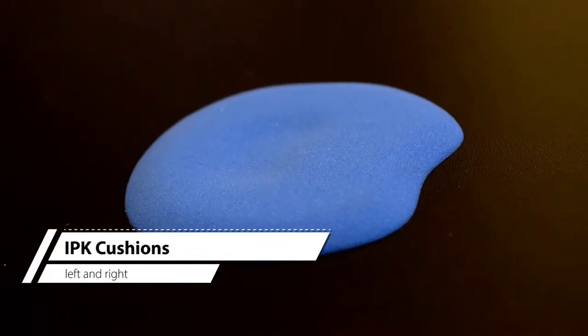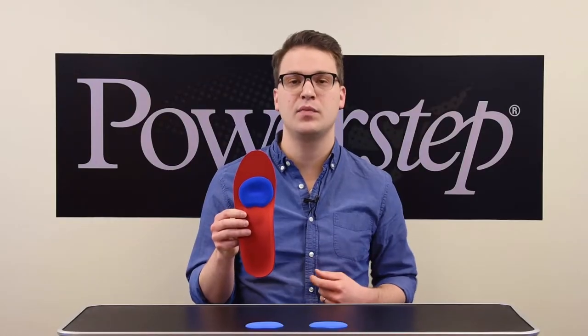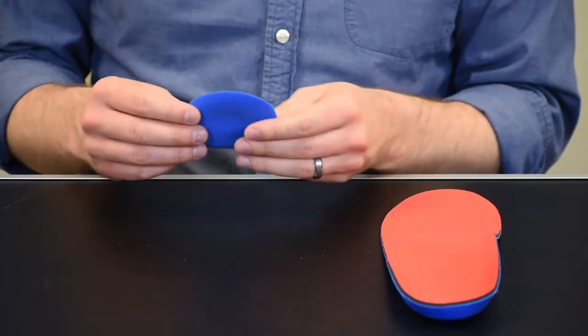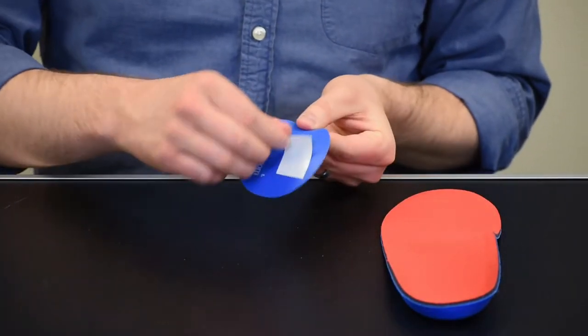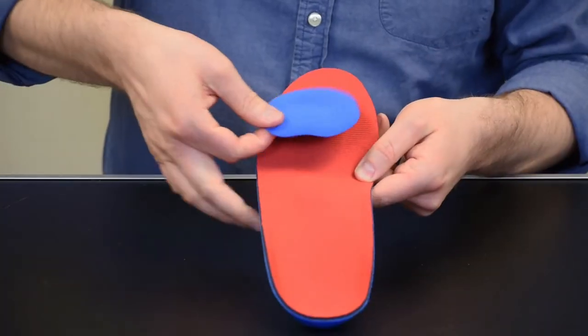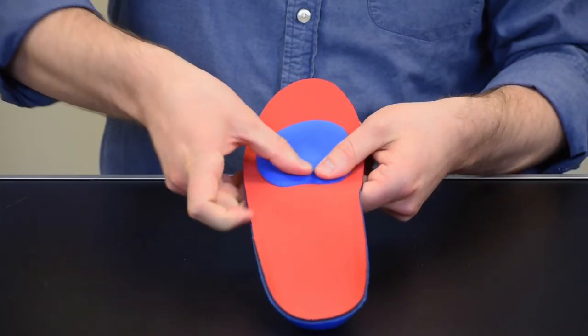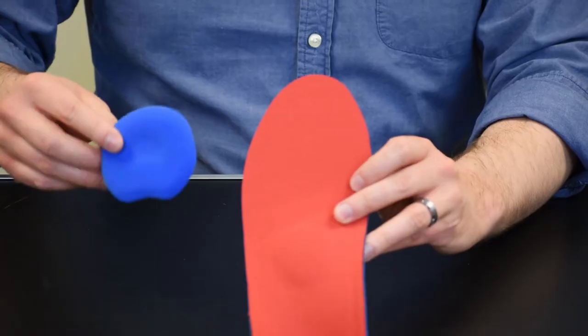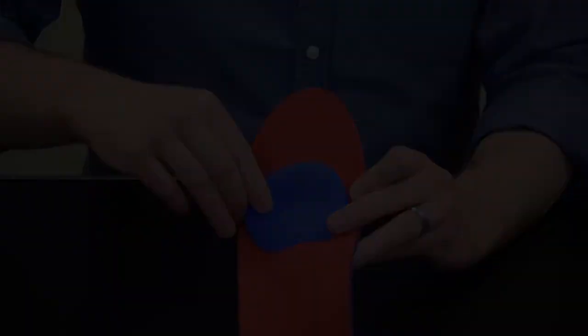IPK ball of foot cushions are used to offload intractable plantar keratosis. These are universally sized and left-right specific. To apply, select left or right and remove the adhesive backing from the cushion. Attach to the top of the orthotic at the ball of foot, positioned to accommodate the IPK in the hollowed out portion of the cushion. Adjust the position as necessary for comfort.